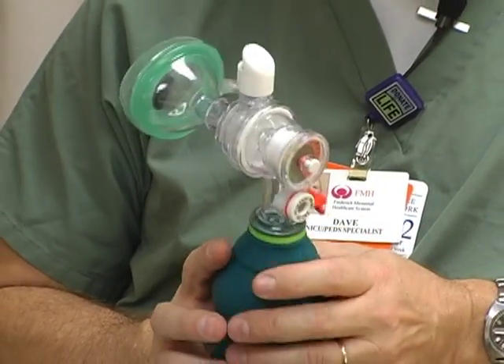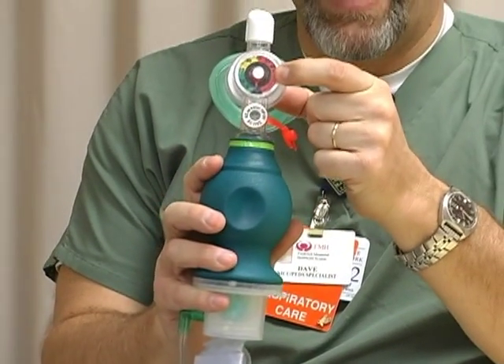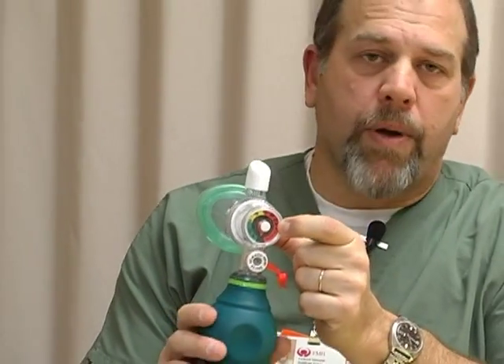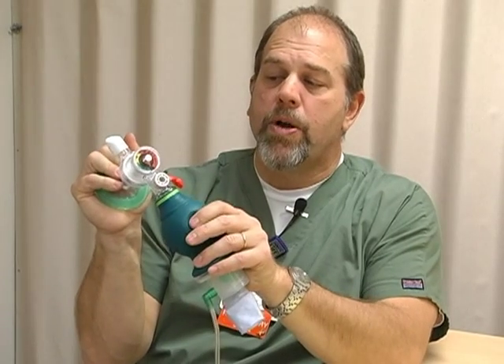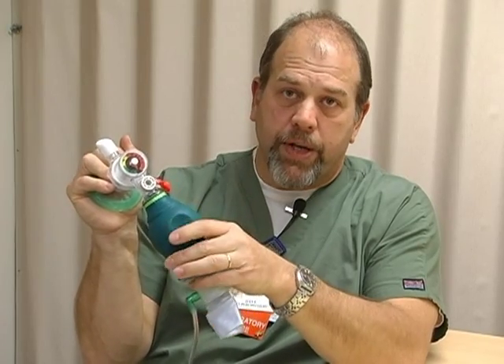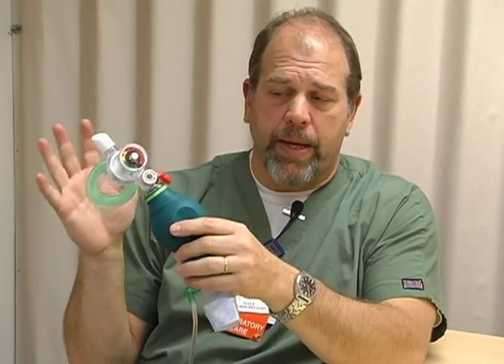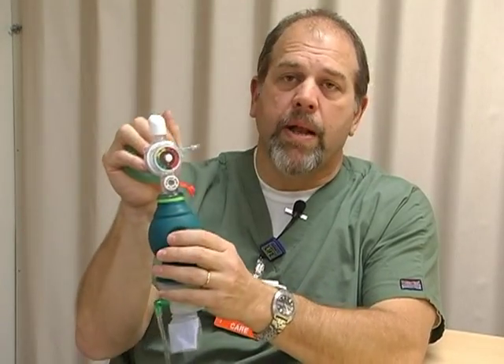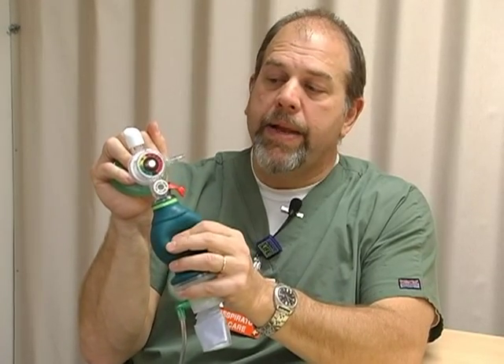Number two: the pressure manometer is now right here at the interface between the baby and you. Instead of craning your neck looking around for where we stuck the pressure manometer, we now have it right at the baby's face so we can see what pressure we're delivering. That's one of the biggest reasons we went to this type of bag — we were having difficulty documenting what we were giving the baby. Now it's right here, color-coded green, yellow, and red.